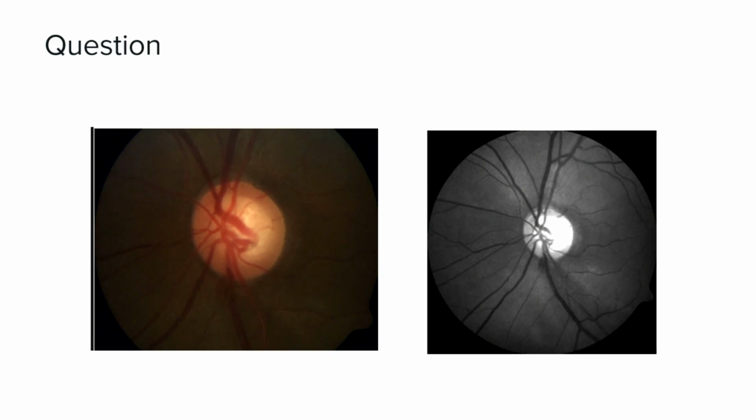Ma'am, this is a normal size disc of the left eye with a cup disc ratio of 0.7 and nasalization of the vessels.